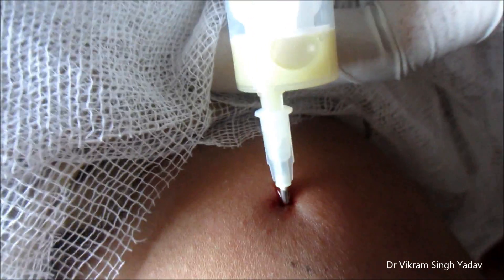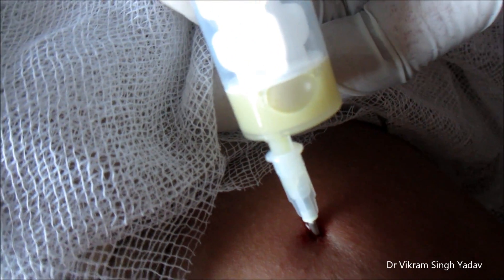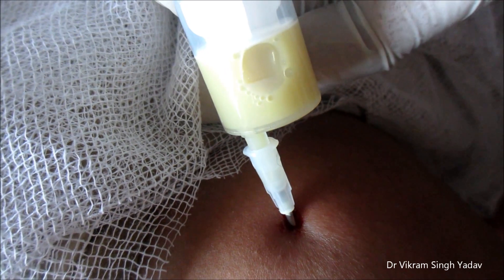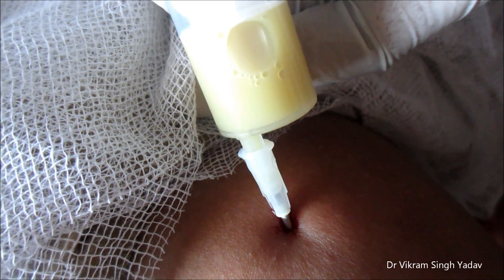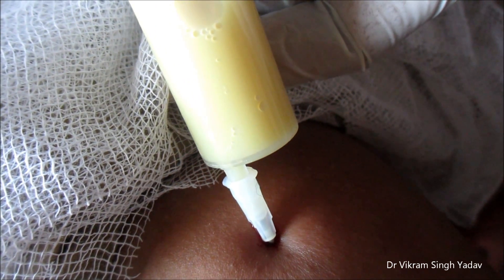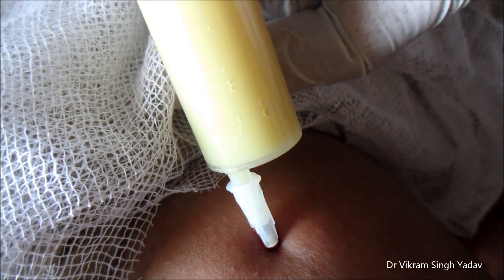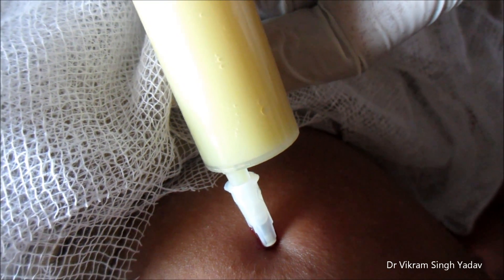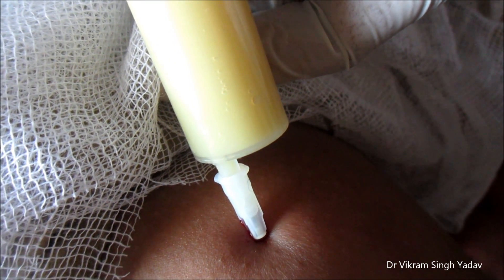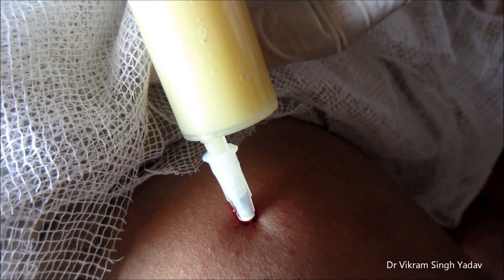Here is the thigh region of the patient, and there was a quite big swelling present over there. It was firm in consistency and when aspirated, we found pus. There were no signs of any inflammation.